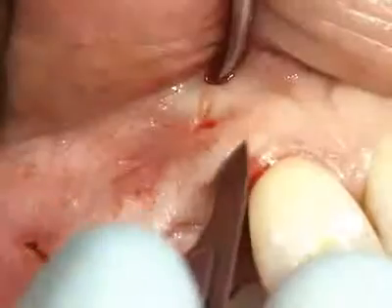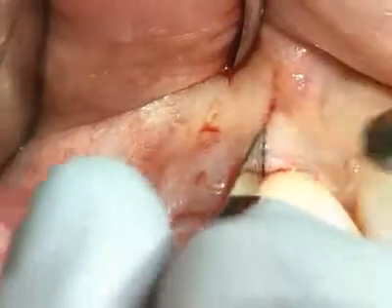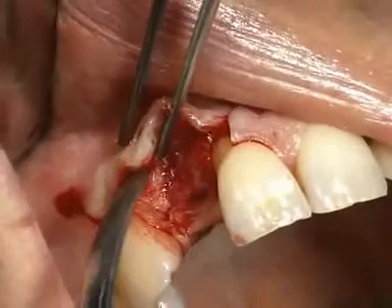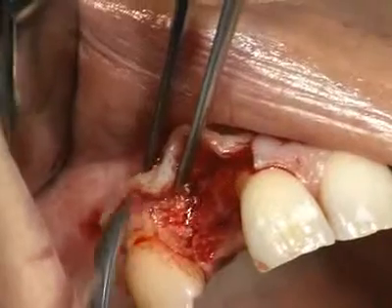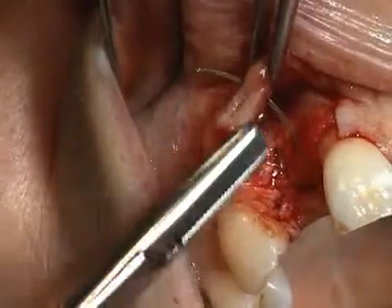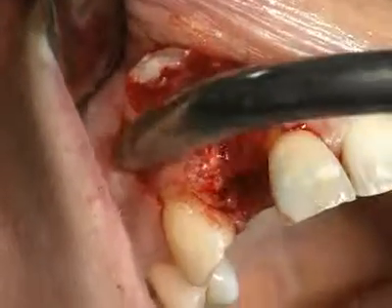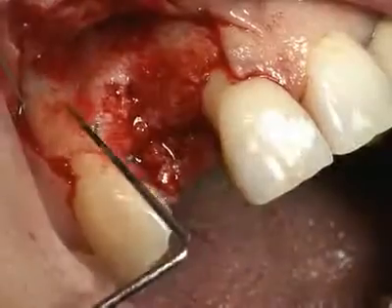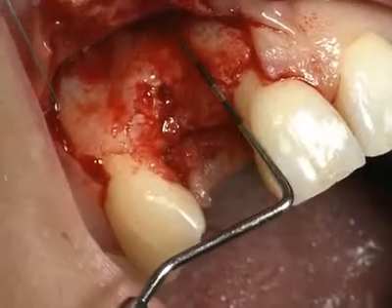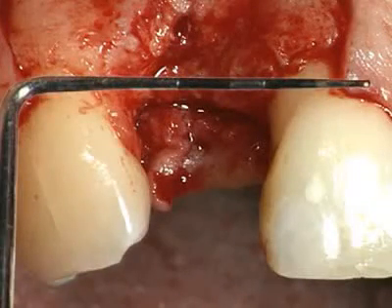The sulcus incision is then relieved vertically in the vestibular direction in the region of the adjacent teeth. The mucoperiosteal flap is then raised completely from the alveolar process. To obtain better visibility, this can then be held in situ with 2 retraction sutures. The probe shows an intact alveolar wall that is moderately atrophic only in the marginal region, while the crestal bone margin is situated about 1 mm below the enamel cementum border.